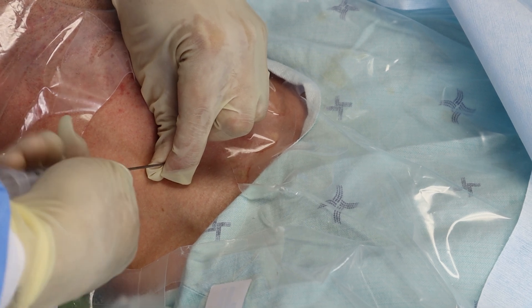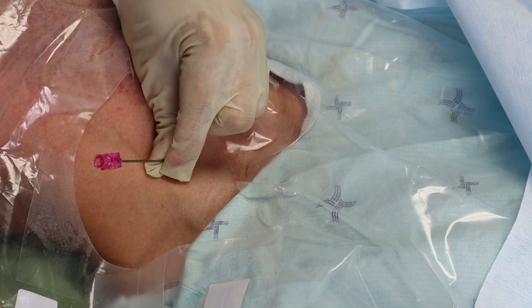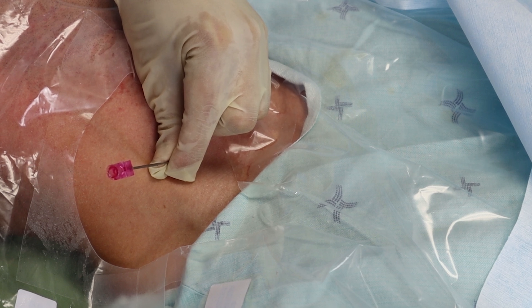I got the needle in the vein and now I'm going to take the syringe off. Are you sure about that, Mike? That looks pretty bright red and pulsatile. That's in the carotid artery. Oops.